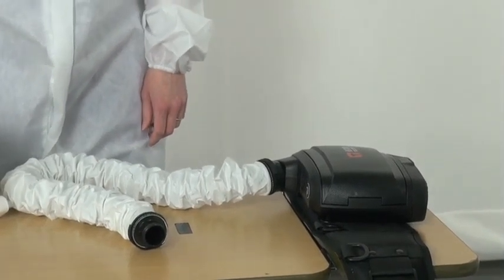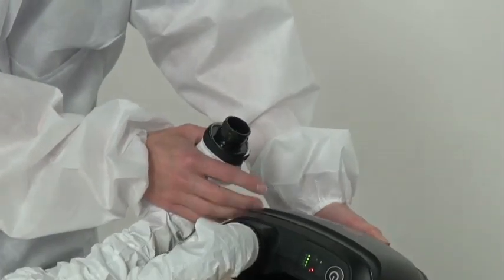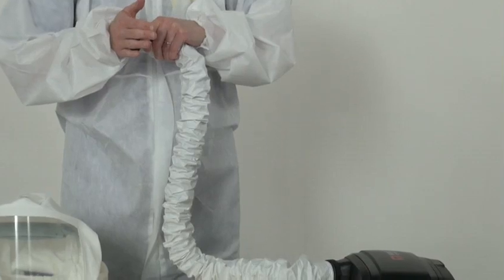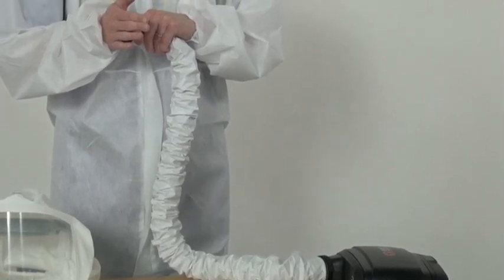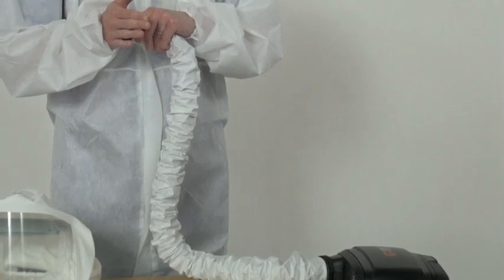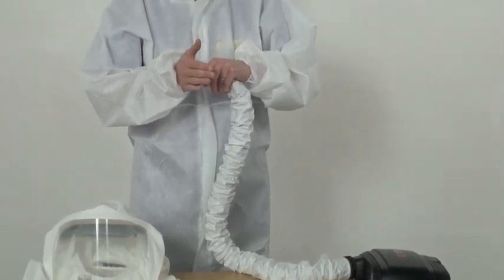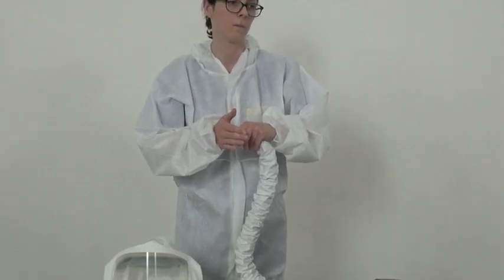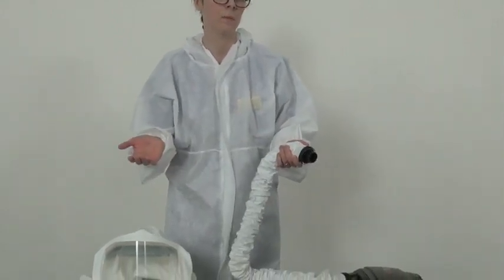Switch on low flow and occlude the open end with hand. Ensure you hear the occlusion alarm after a short time. The unit remains in operative mode. Remove occlusion and wait for alarm to silence.